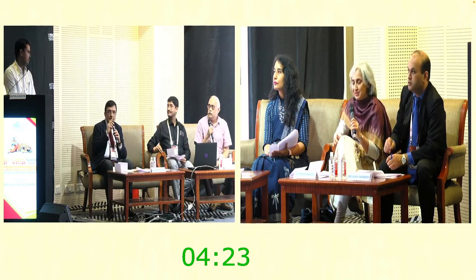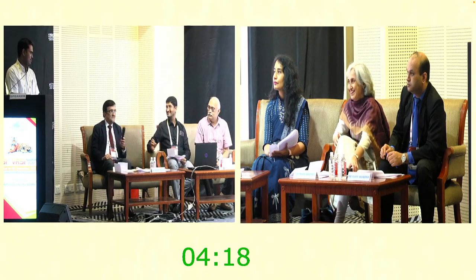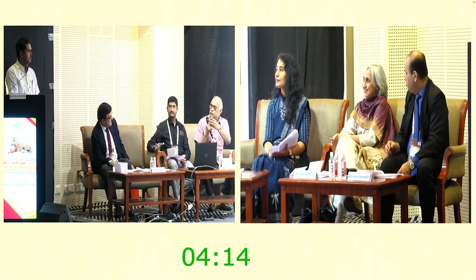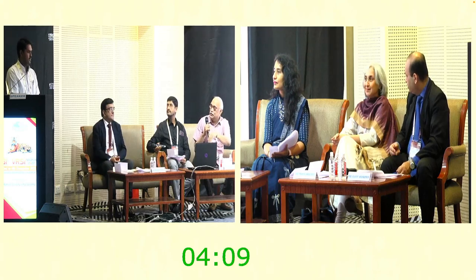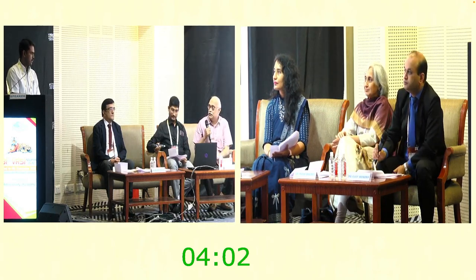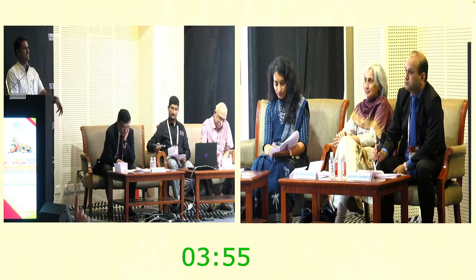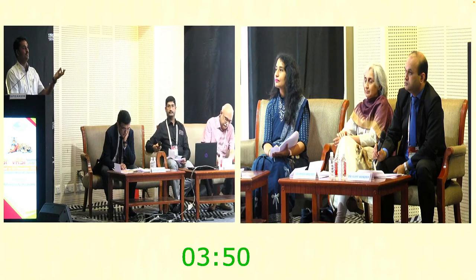Thank you very much. Your take home for the audience is that you should have Abgel in the theater available. Probably the rupture is too posterior in some cases where we can't suture the posterior aspect. You can go in like this, sir. This is what I did in my first case, a posterior rupture which is difficult to suture. The first case which I did was the same. It was an impacted foreign body which I pulled out and everything started to run into the retrobulbar space. That was when I first used this, but I didn't use it in such a large tear, ma'am.